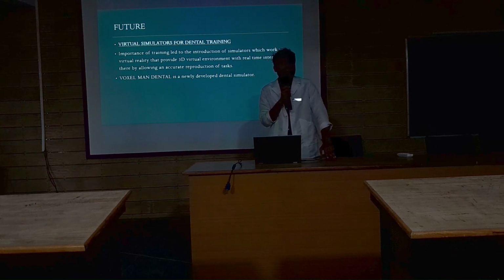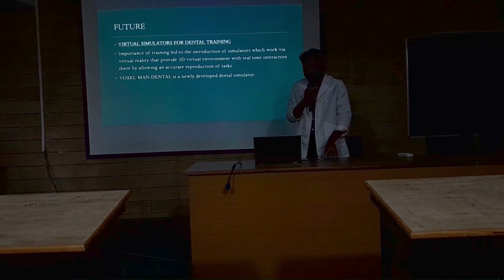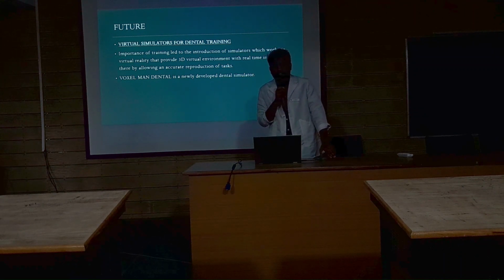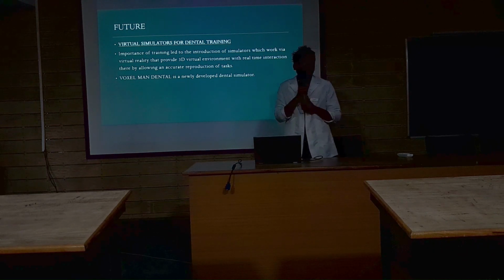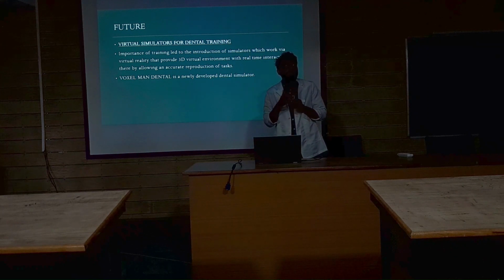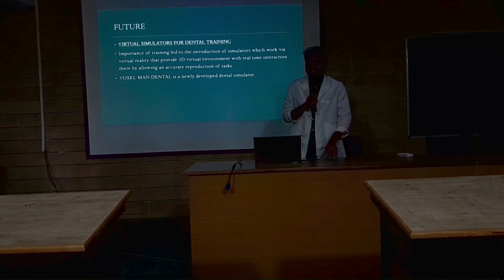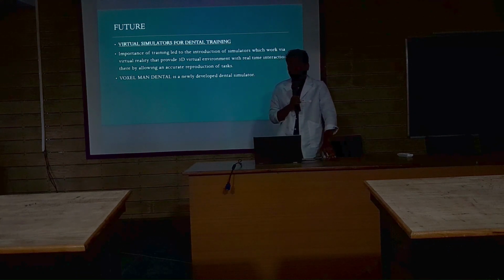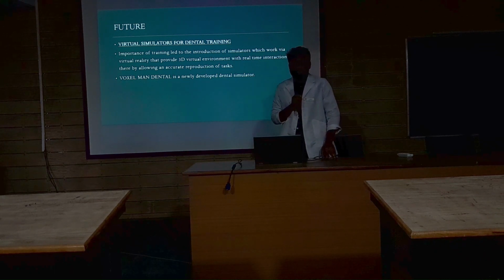during our second year we do preclinical conservative. We use the typodont teeth to create cavities. So actually it's not a correct method. We don't have any differentiation between enamel, pulp, dentin like that. We simply cut the cavity in the resin tooth model. So the scientists have led to the invention of virtual simulators, that we can see.